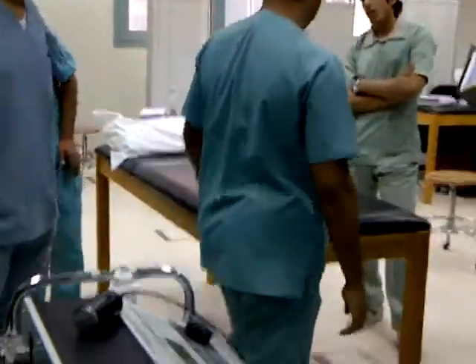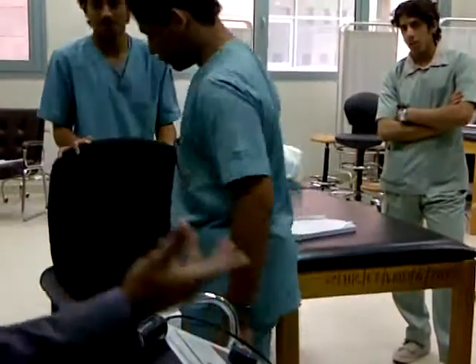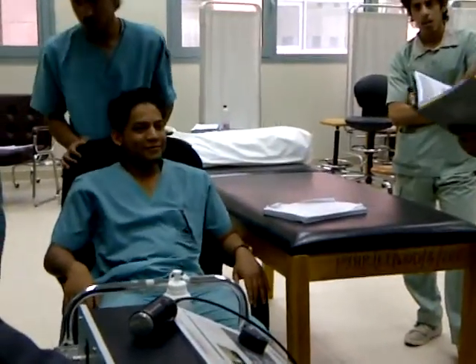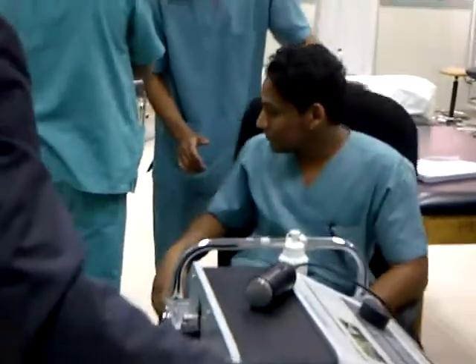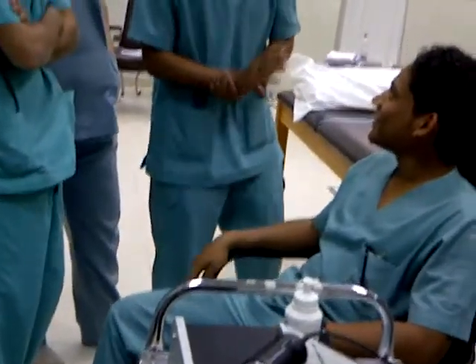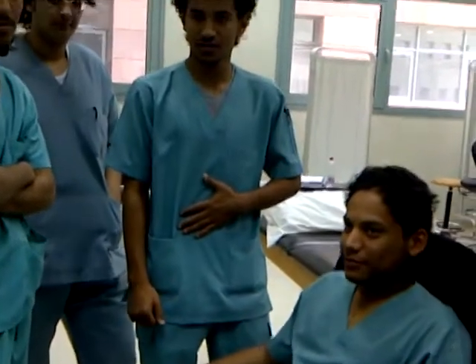Everything is positioned here: armrest, without armrest, backrest. Give him a comfortable position.